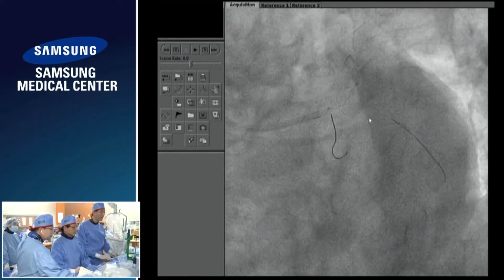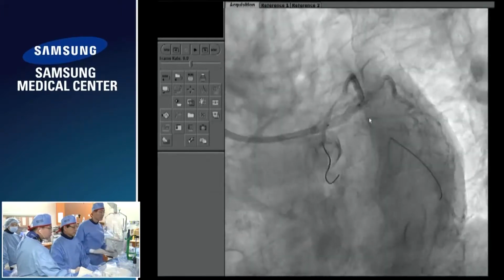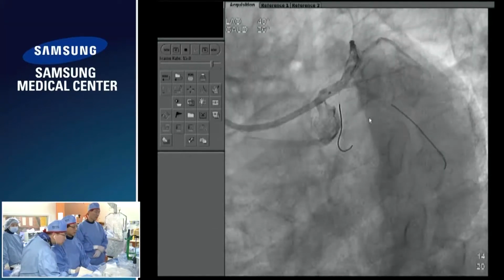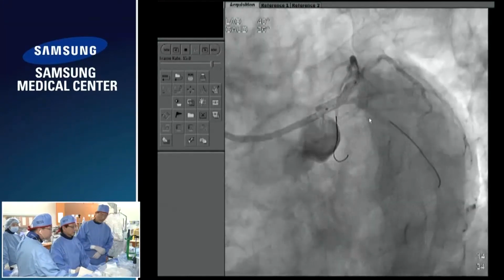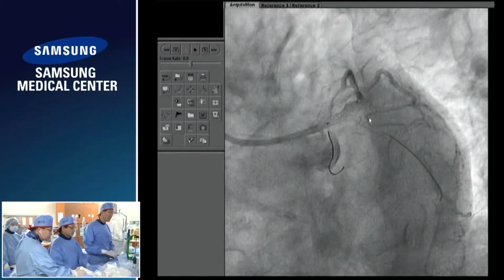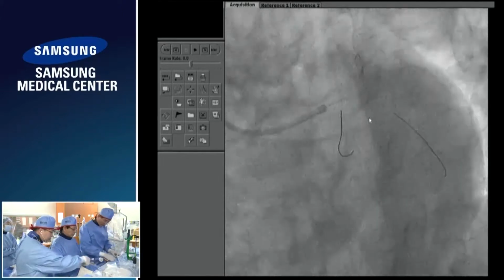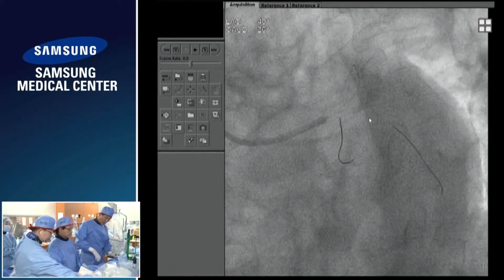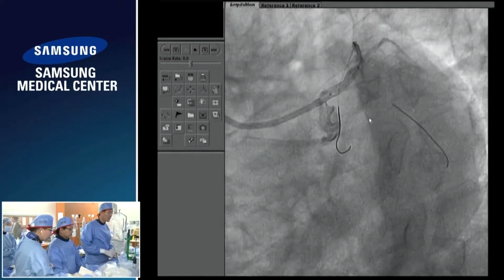Prepare the angio. Yes. Shoot. So, what do you think? We need to rewire at this moment? Yeah. Okay. So a little bit compromised, not too dangerous, but I like to remove the balloon and wire together. It's quite easy, quite safe to remove the wire from circumflex.